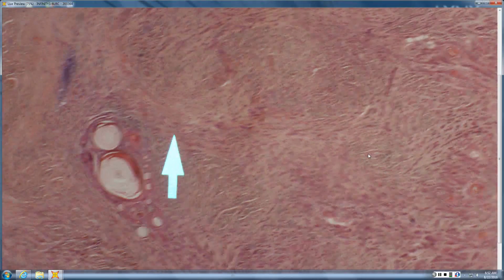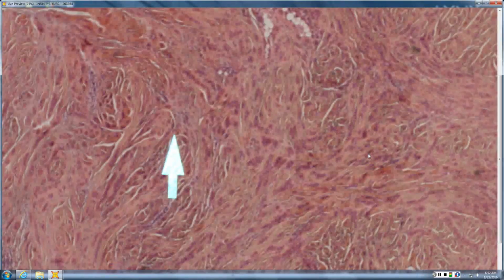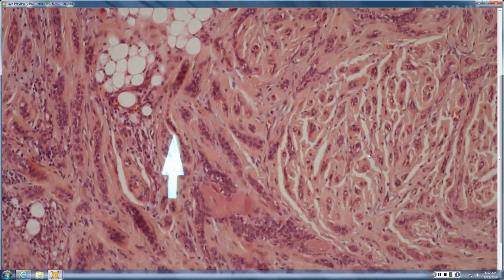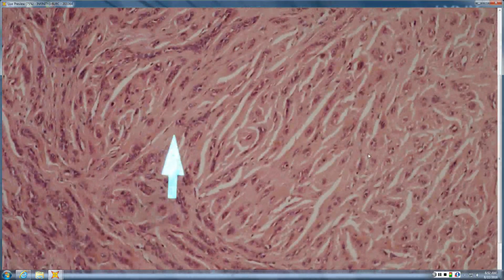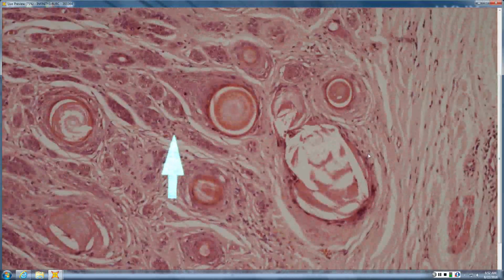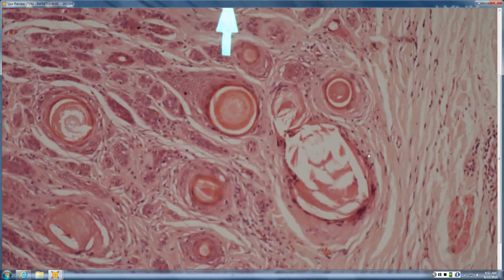And if you searched, which I don't really have the time to do, you would probably find some perineural invasion. And of course, that's never good, and that also helps push you towards it being something bad. So now you can see up close why it might be hard to distinguish from a morphoeic basal cell. Getting back up to the superficial portion, some of these areas are probably keratin in there, and it can be hard to distinguish sometimes, whereas this is more that amorphous schmoo that's probably actual sweat.